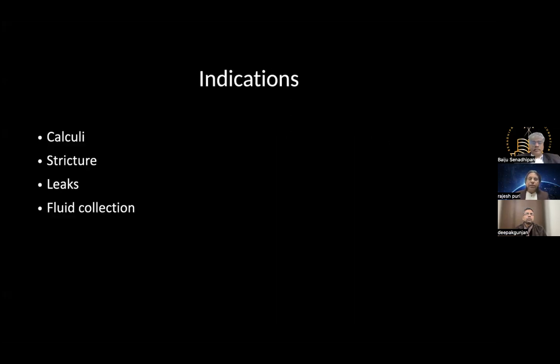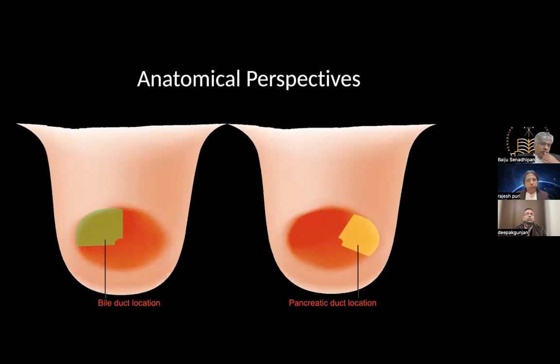As I said, the diagnostic pancreatogram no longer exists. It is replaced by the MRCP. We only do the pancreatic duct cannulation when you want to deal with calculi, strictures, if there's a leak in the pancreas, or in a patient of chronic pancreatitis with fluid collection.